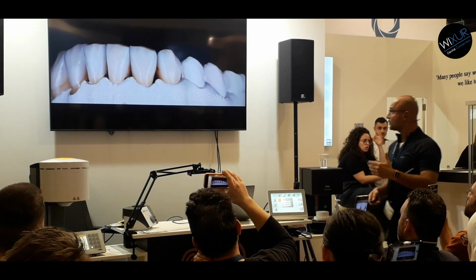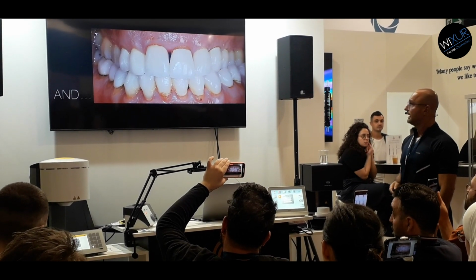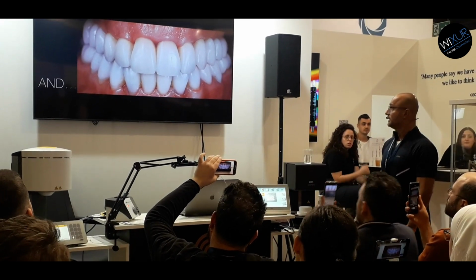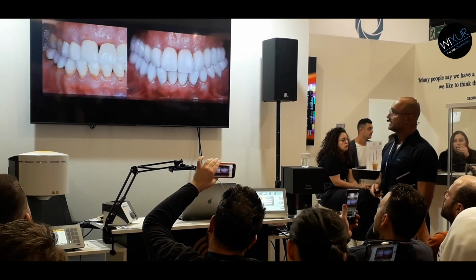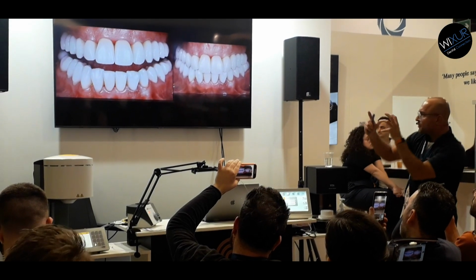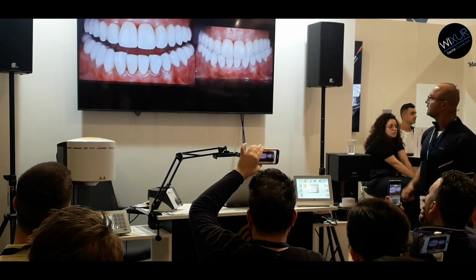So a lot of hours, a lot of work, but systematic, step by step, slow dentistry. So we started here and we finished here with 28 restorations, LT bleach 2, facial, layered, and the rest is only monolithic and staining technique, mechanical polishing. So we played a little bit with the form, we made the form a little bit more aggressive in order not to have just white Hollywood, not beautiful teeth.